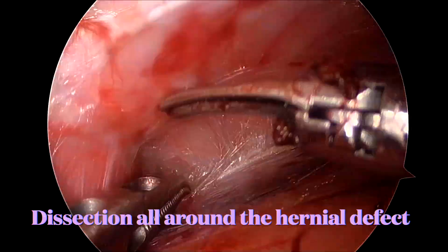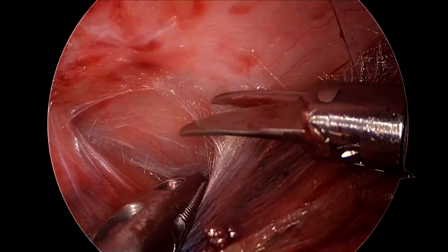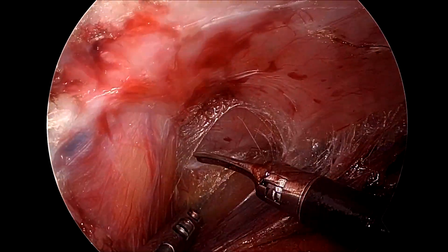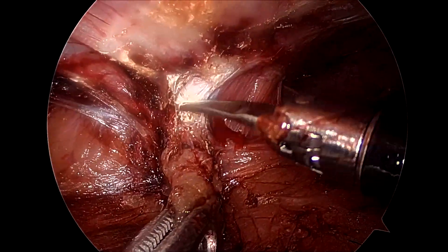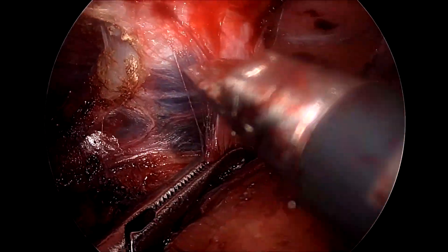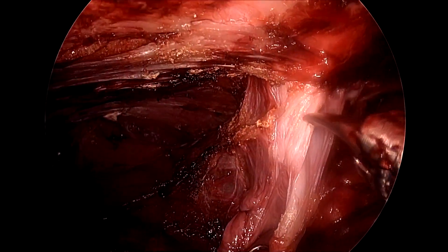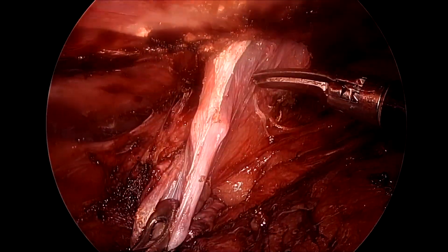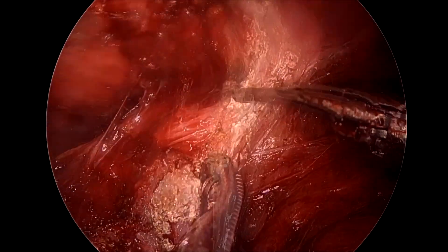We always do the dissection on either side of the hernia defect before approaching the hernia defect itself. Here you can see we are using sharp and blunt forces to dissect all around the hernia defect. While working on the hernia defect, we push the pseudosac up as the pseudosac is dissected down. Immense care should be taken to ensure that the umbilical skin is not injured during this dissection.